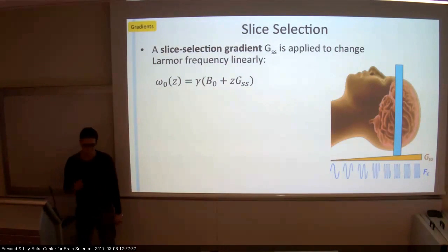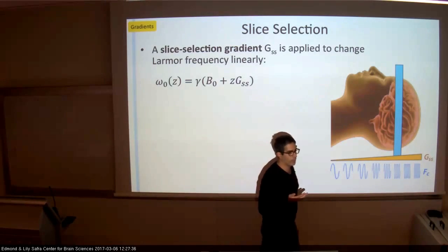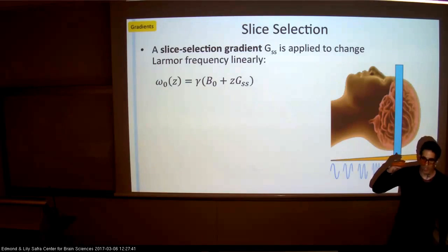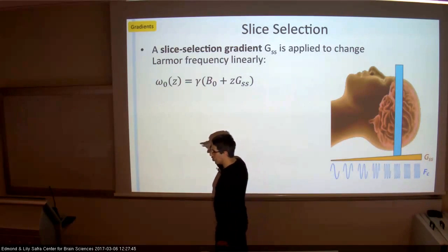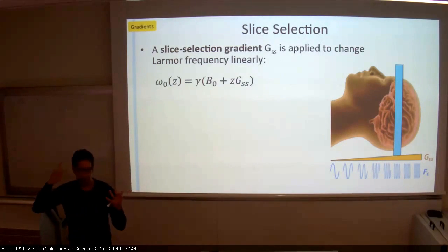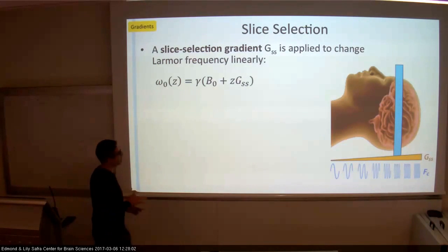So now we need to encode. We have 3 dimensions in our image. It's a volume. Typically we can think about a slice, some location in the brain. Our brain problem is a 3-dimensional problem. So I'm going to first move it to a 2-dimensional problem, and then we'll talk about 2-dimensional encoding, which is going to be more of the same, kind of, though slightly different.